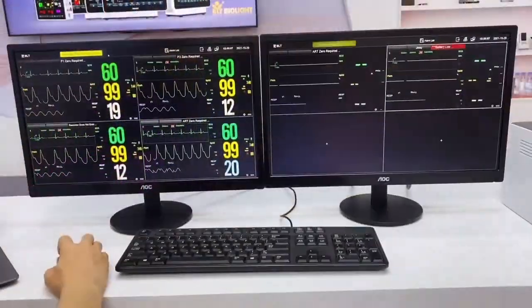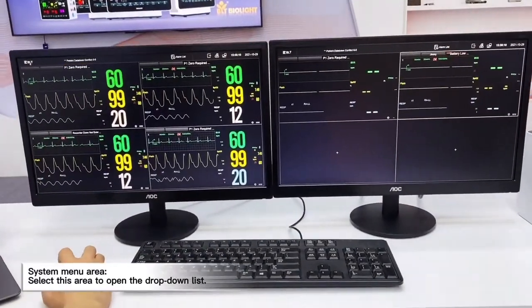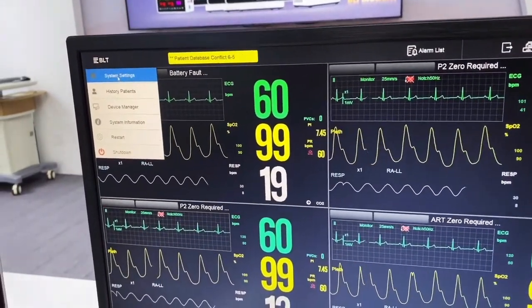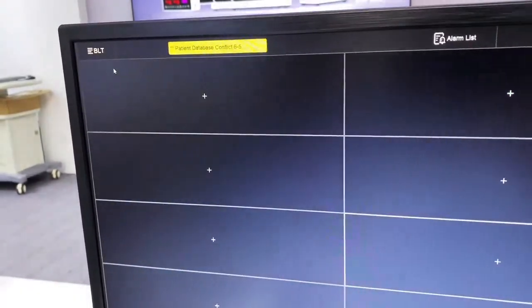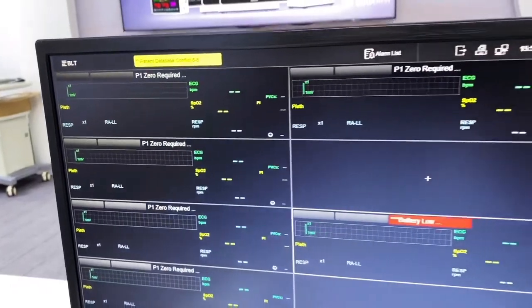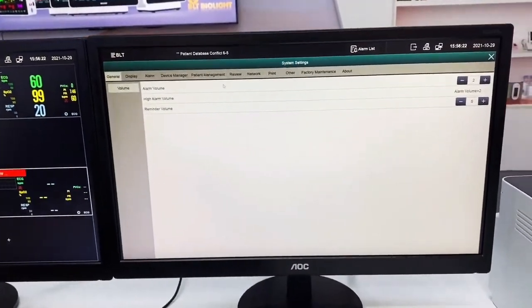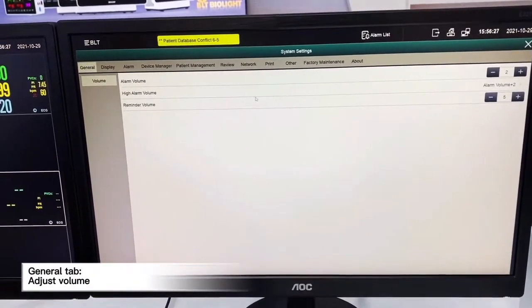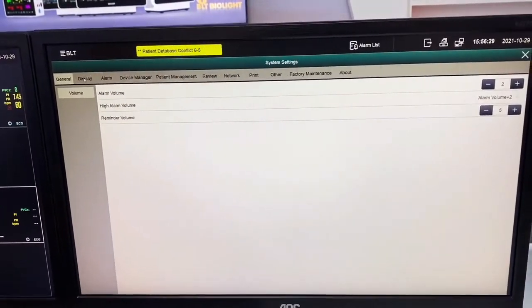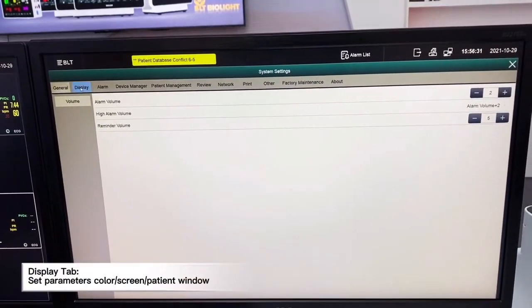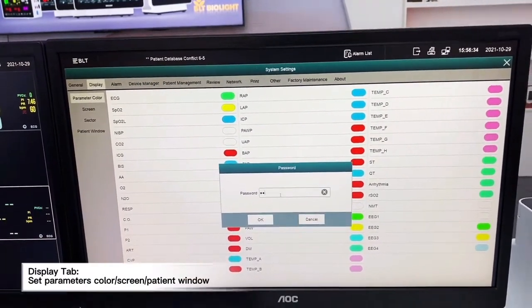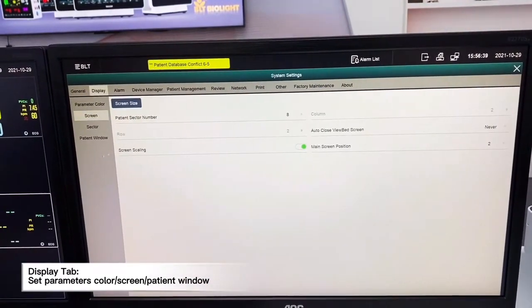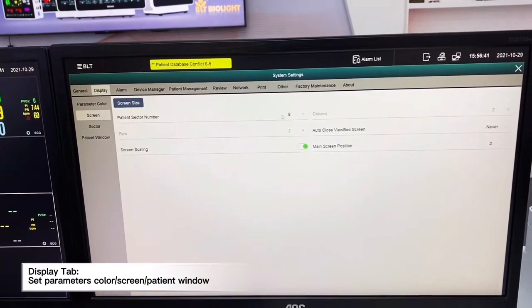When we go to the BioVision interface, on the left corner you will be able to see the manual settings. We can click on to the system settings. The first is general, and we can customize the volumes. The second option is display, and once we key in the passcode we will be able to customize all the parameter colors. If we want to change the display layout, we can select here.